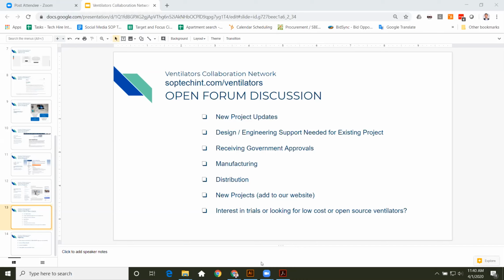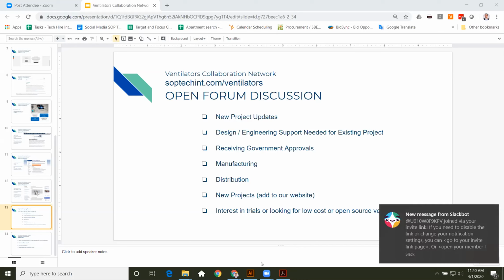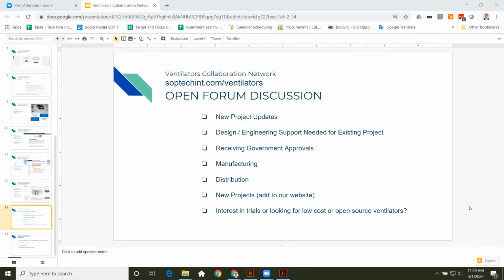So as far as motor selection, I guess Robert's comment's fairly valid. I don't know that we could limit anybody, but every one I've looked at basically was a Hall effect or some gear motor that could reverse polarity and reverse direction and move in a controlled manner, controlled by a computer circuit. I think that's maybe as far as you have to go on motor selection. I would suggest we look at other options for those who feel inclined, because you're going to run out of those motors very quickly, and the boards to control them.